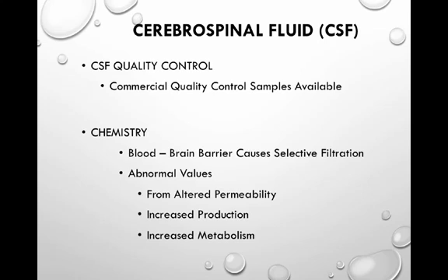There are commercially prepared quality control samples that should be analyzed in parallel with the patient's CSF. Labs have special CSF QC for cell counts and chemistry testing.